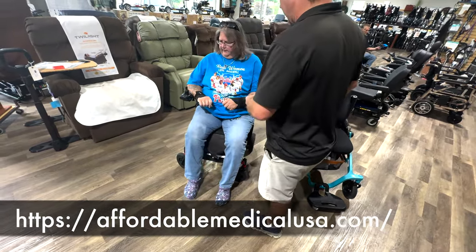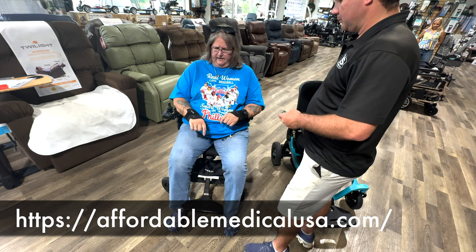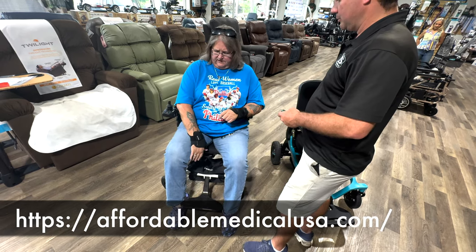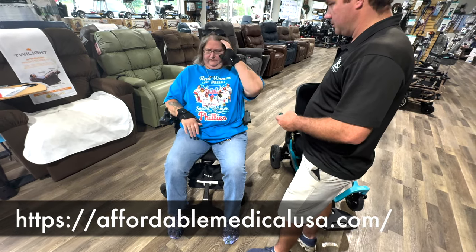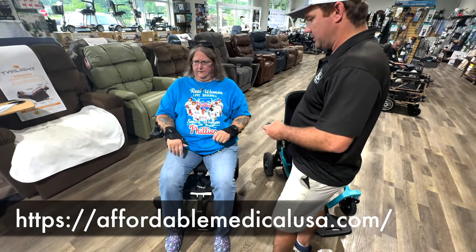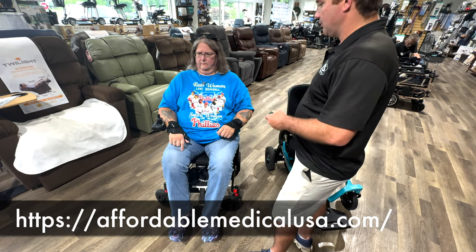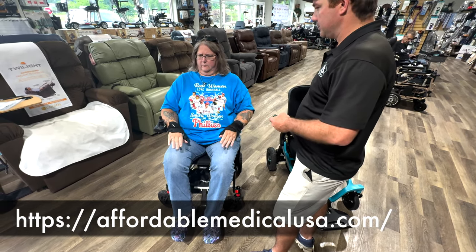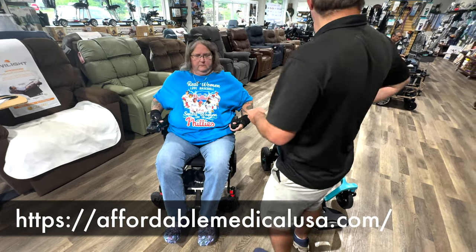Denise, I didn't know that. Okay, this is too short for me. They're almost the same. Can't change that. Except that this one... All right, you ready for the rating? It's 27. Okay. That's 47. Look at the wheels, that was digging in the back. Yeah, oh yeah, they just stand out a little bit farther. How tall are you, probably? I'm 5'9". 5'9", okay. The cushion can be changed though, just so you know. So right now, would you rate it? The back and seat are comfortable. Okay. I'd give it an 8. 8? Uh-huh. Okay, well done.